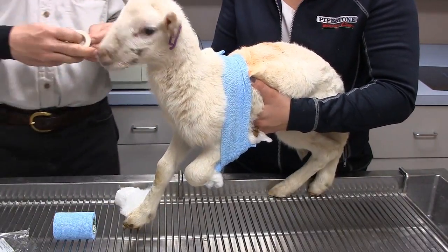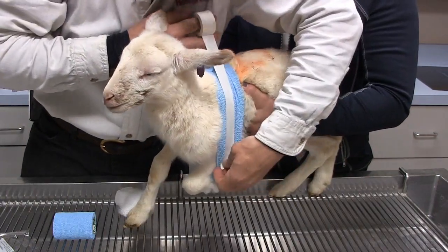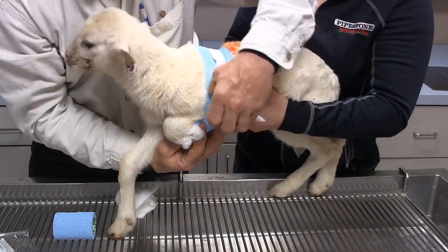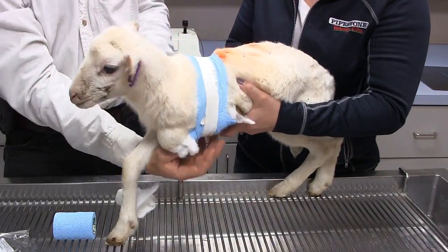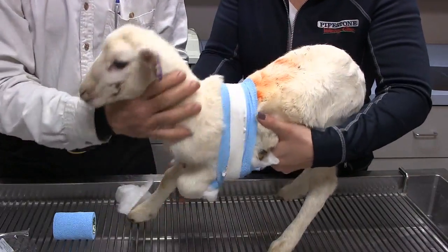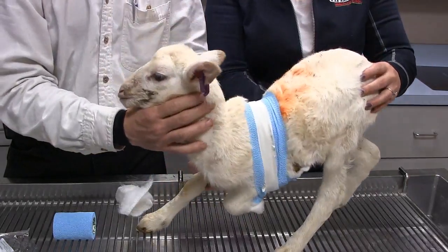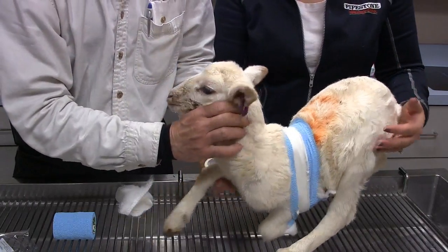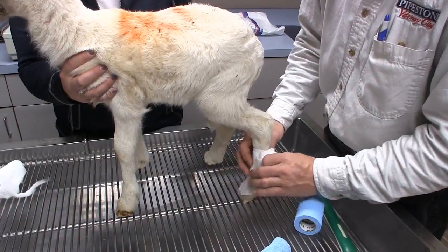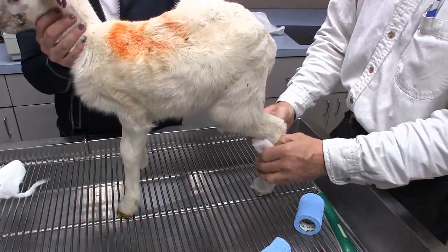This would basically prevent the lamb from extending his shoulder, bearing any weight on the leg. We're going to add some white bandaging tape on top of that to maintain some of the pressure, and in both cases we would like to leave this on for about 2 weeks. Obviously in this case the lamb's going to figure out how to walk around on 3 legs. It takes about 24 hours for the lamb to figure that out, so it might need help with nursing during that time.